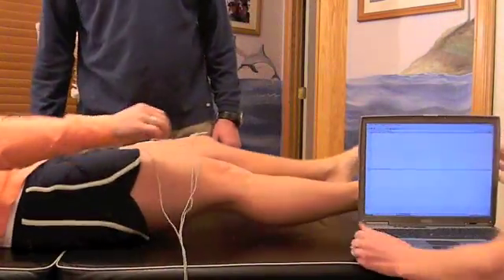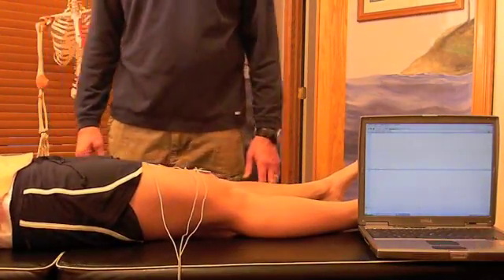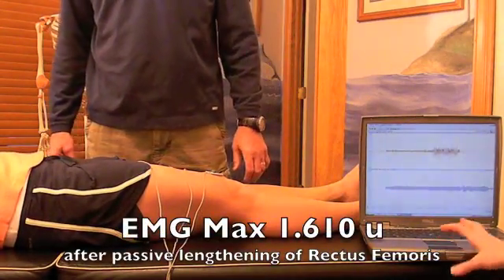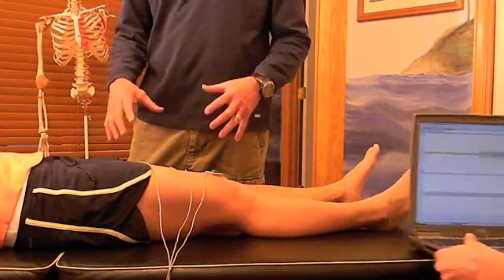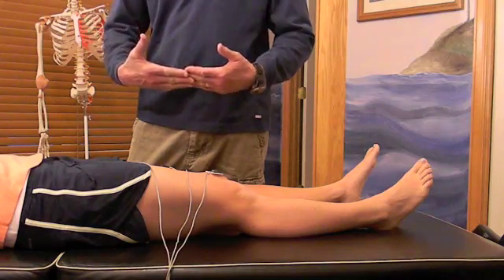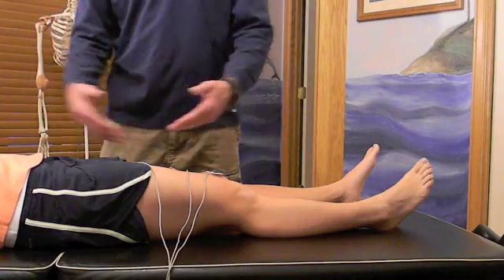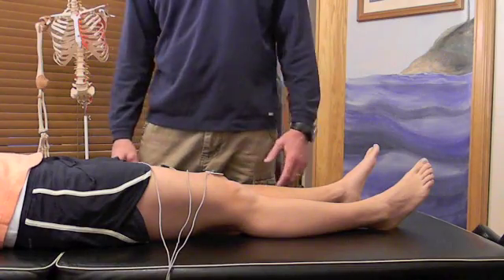Now we're going to do the same test on the quadricep. Dana, lift your leg — hold it there, ready, resist. What we're seeing is that when she passively stretches the rectus femoris muscle, she is taking it past its active range. What's happening is the Golgi tendon organ is sensing additional stress at its end range, and the nervous system is now inhibited from getting information to that muscle to contract and sustain that same force output.